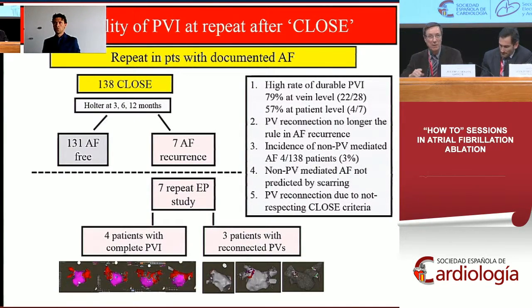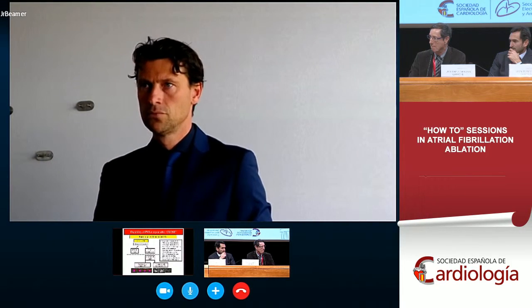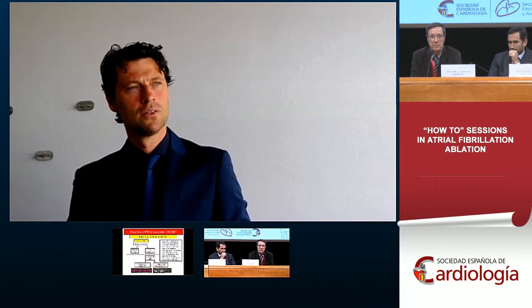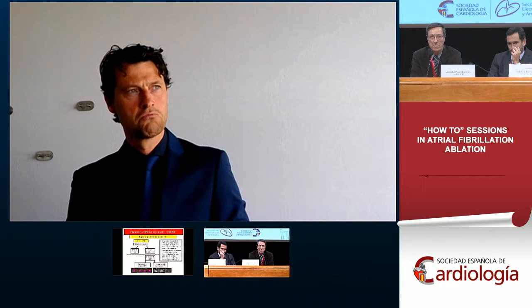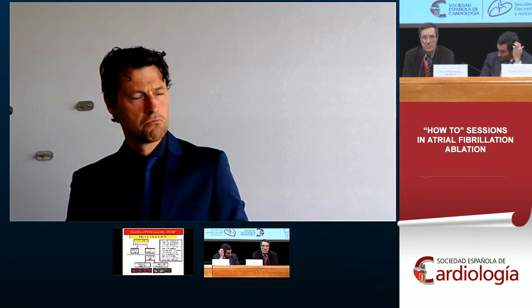Well, yes, last question. Dr. Pérez Castellano. Congratulations, Mattias, for the talk. I'm asking you if you modify the flow rate during the ablation in the closed protocol, and I suppose you use the conventional temperature limits of 45, but particularly with irrigation, do you modify it?